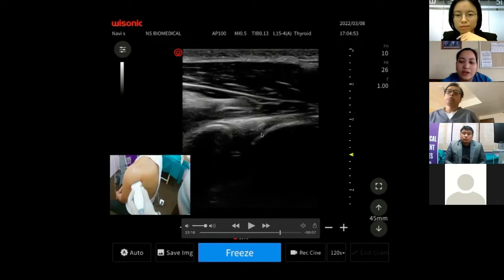This joint is very important from the perspective of pain management, because treatment of the posterior glenohumeral joint has been shown to provide better analgesia in case of adhesive capsulitis. It's not only static imaging; by dynamic imaging, we can see whether there is even minimal effusion in the posterior glenohumeral joint. We can just ask our patient to internally or externally rotate their hand, in which the head of the humerus will move and even a minimal amount of fluid can be seen at the posterior joint recess.